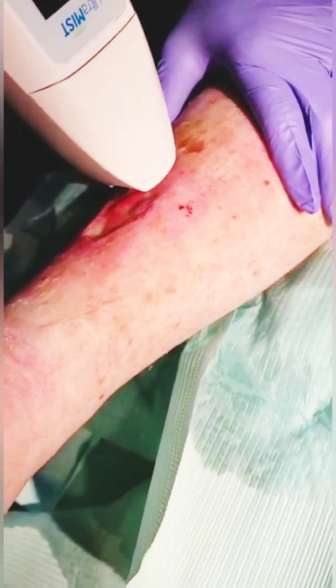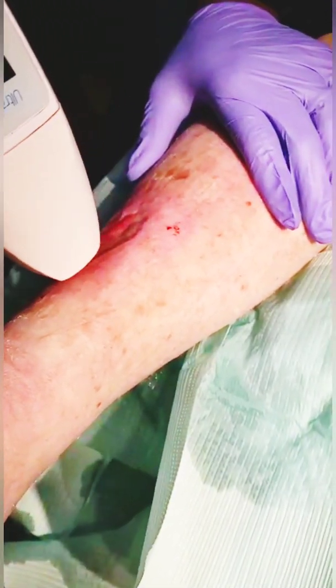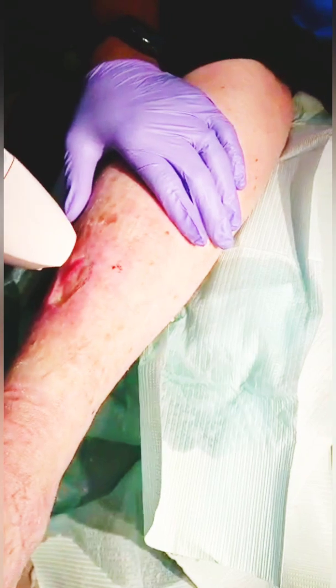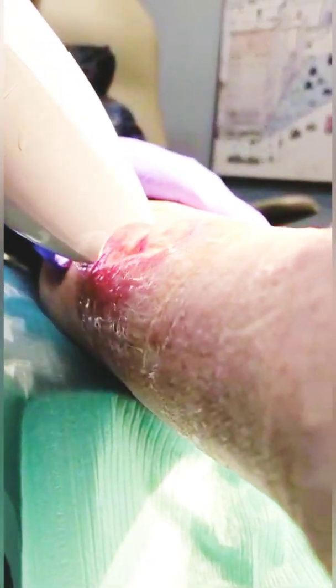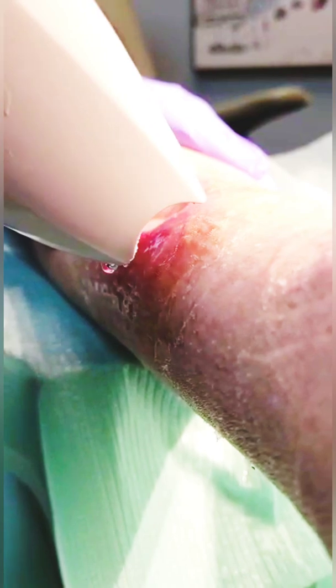Very soothing. We're very optimistic that we'll be able to stimulate this wound atraumatically and get her continually healed. I can see the reason for one-time use right now. What are the indications for this, Leah? It's indicated for wound healing — all wounds, head to toe. This is a lower extremity ulcer of traumatic origin, correct? Yes.